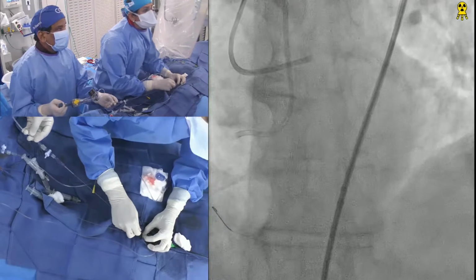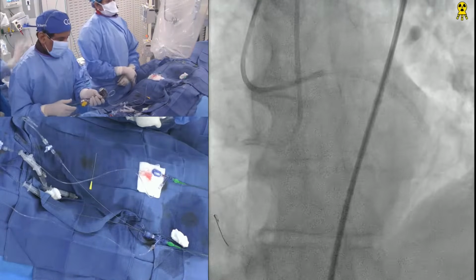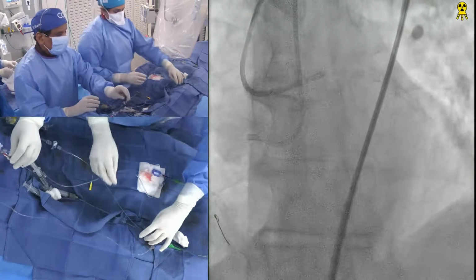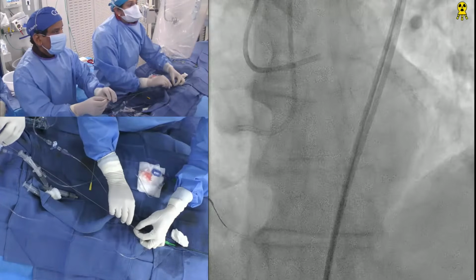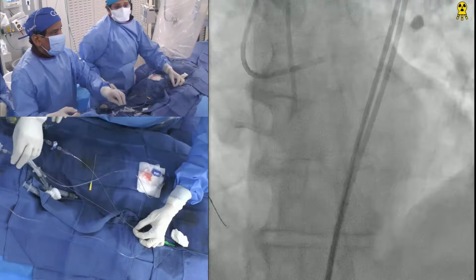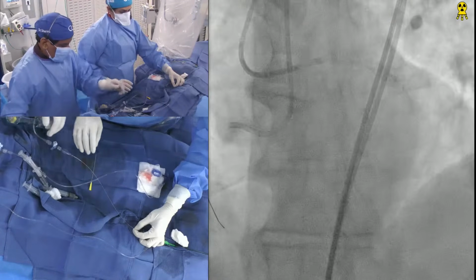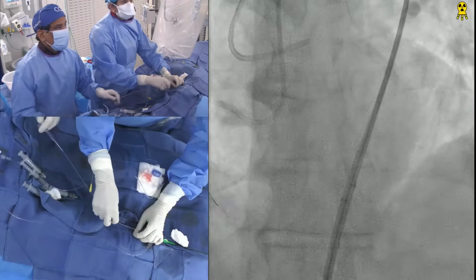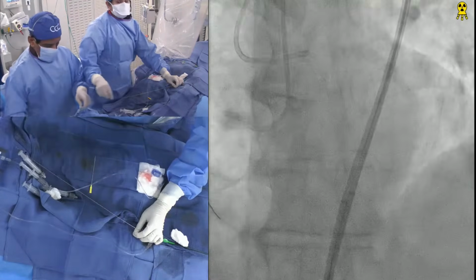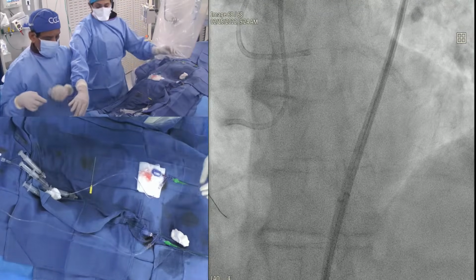Good, that's it. I'm going up. Patient was ready. Let's take it out. Okay, I'm taking it out. Did you go up? Okay, I'm deflating. Good.